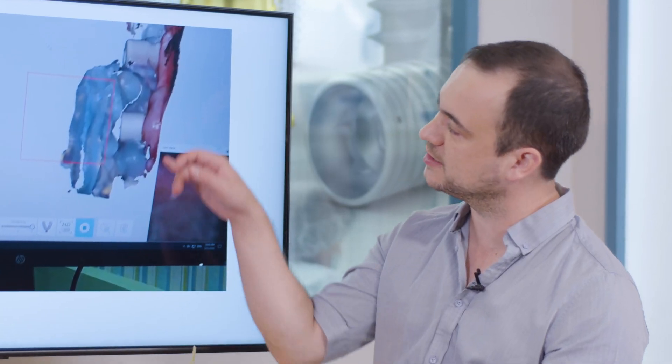It will fixate on the scan abutments, the height of the restoration that I want. And you can still see the scan abutments on the screen.